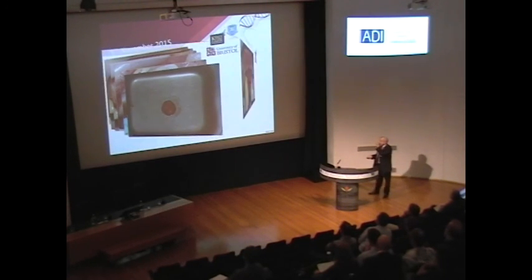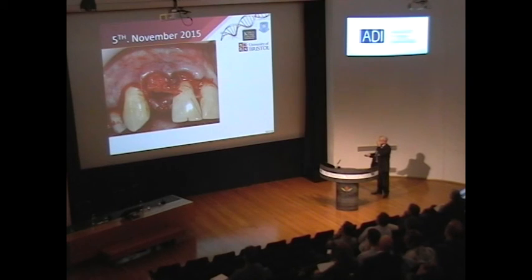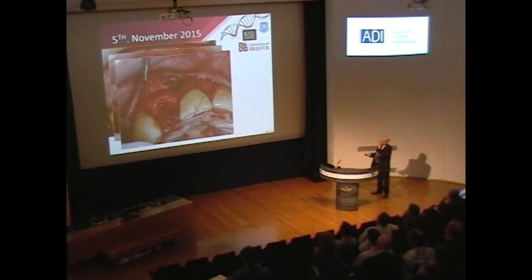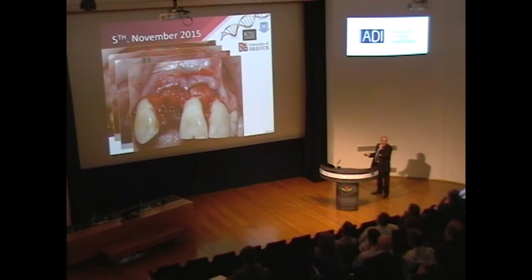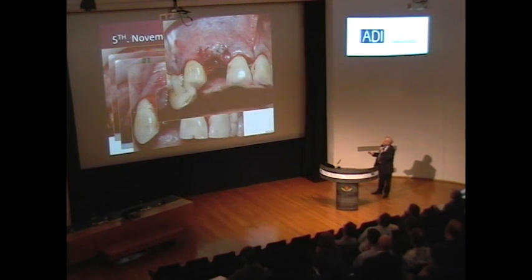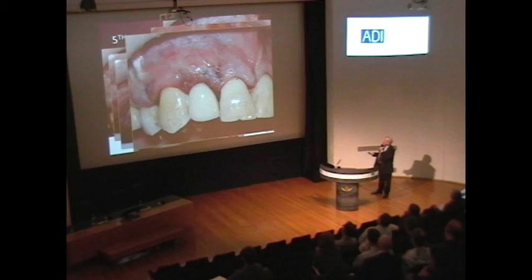We're going to be very happy with the results here, because not only have we got the volume enhancement, we've got this massive amount of pocket lining pedicle flap to close it off. We do not want to compress any of it because we are looking for bulk. Alright, so the suture technique is reapposition of that flap. That was a very beautiful little case, and we could see the volume. And that was my little presentation.